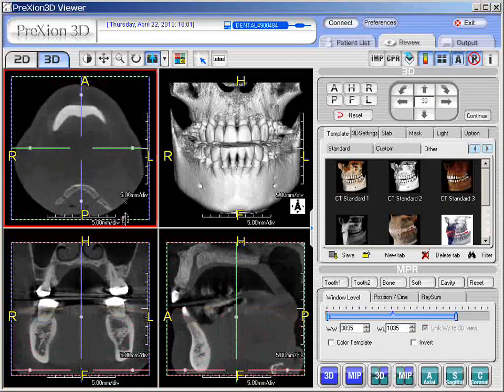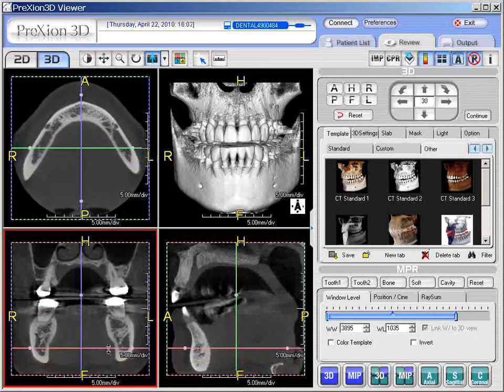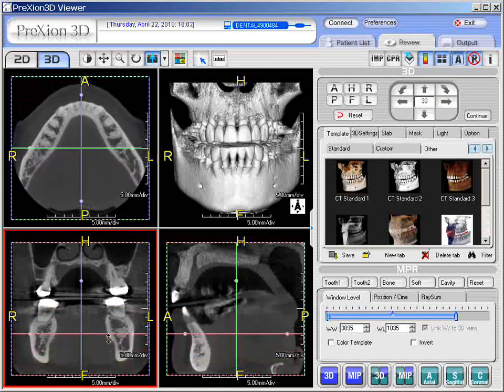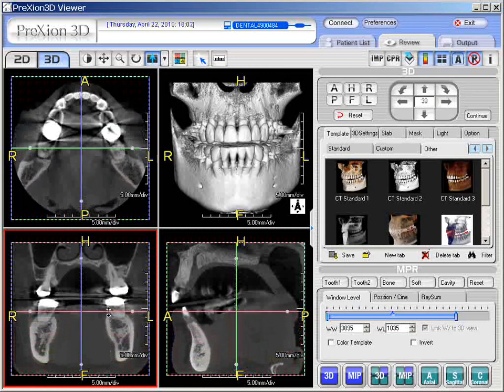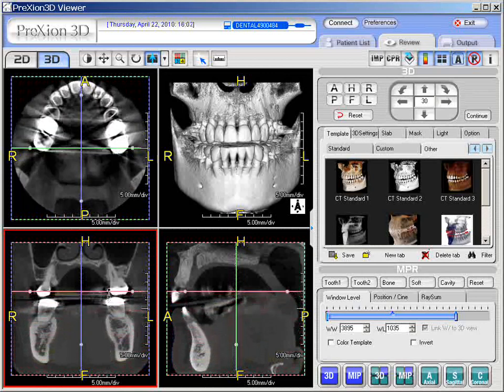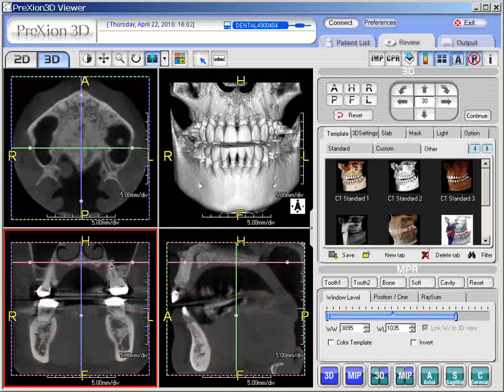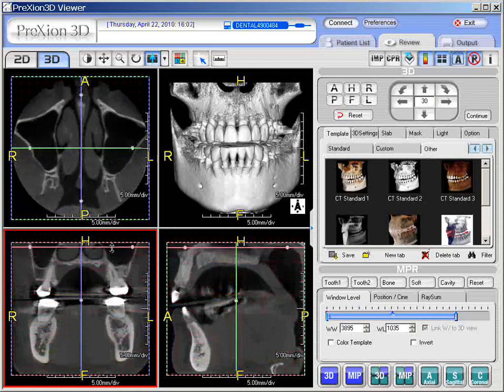The other method is you could grab the horizontal pink line in the coronal plane. If you click it right here — notice the double arrow — left clicking it and slowly dragging it to the superior plane as we move upward through the mandible, through the crowns of the teeth, up through the occlusal plane, through the maxilla, and up through the lower maxillary sinuses.